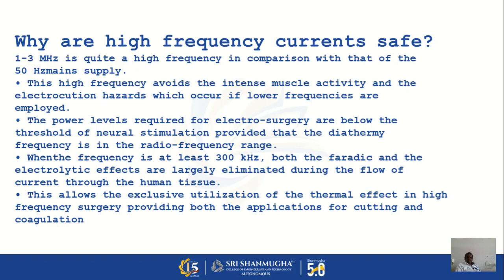This high frequency avoids the intense muscle activity and the electrocution hazards which occur if low frequencies are employed. So simply we can say it does not stimulate the muscles and nerves, and the low frequency will stimulate the muscles and nerves. So that's why we are using the high frequency.